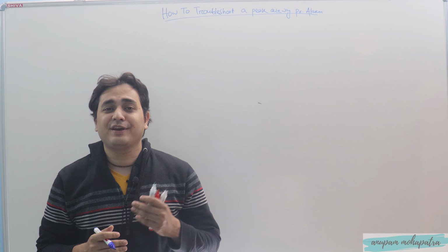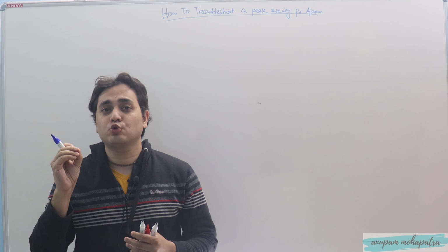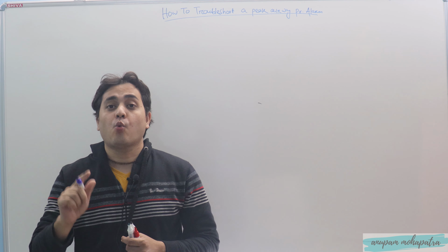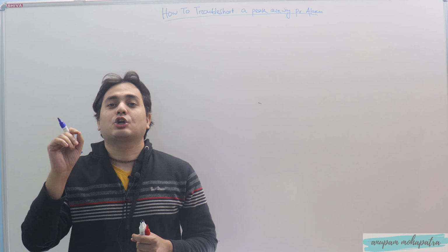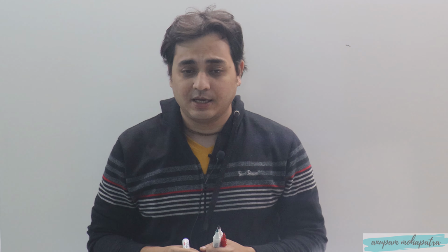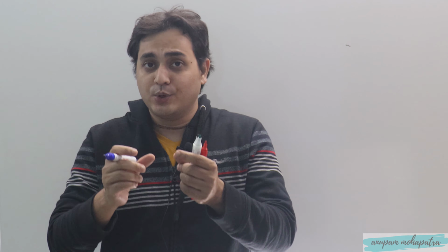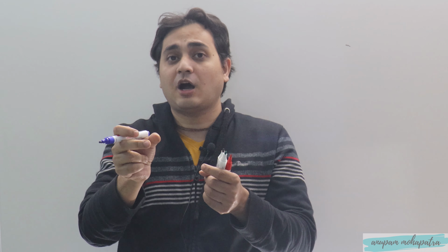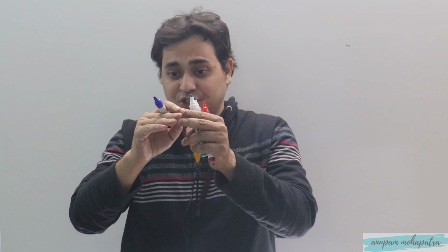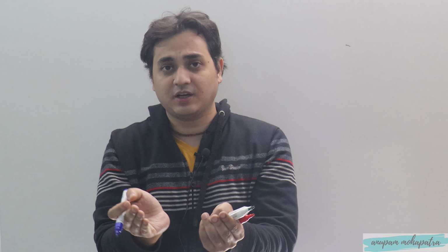Before going to fix or troubleshoot the peak airway pressure alarm, we have to discuss two very important concepts. One is called resistance, another is called compliance. Before going to the chalkboard, I want to say something. Consider the lung as two units connected together. One is the tubular structure, which is the upper airway, and the other is the globular structure, which is the lung parenchyma proper, or the alveoli. These two are connected. Correct?